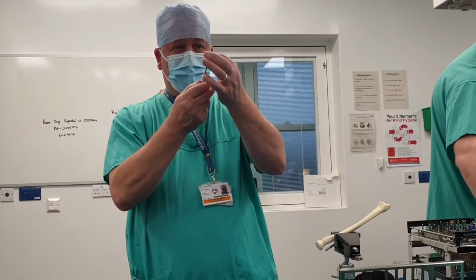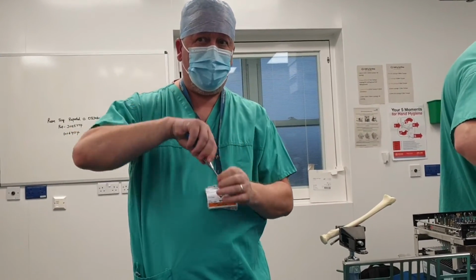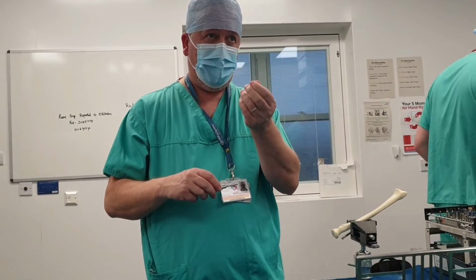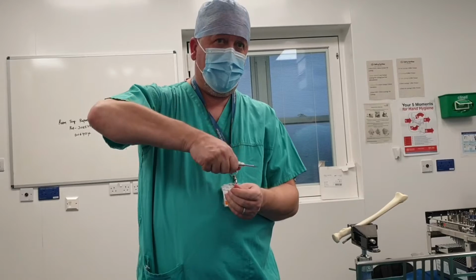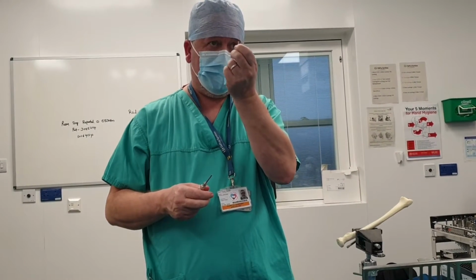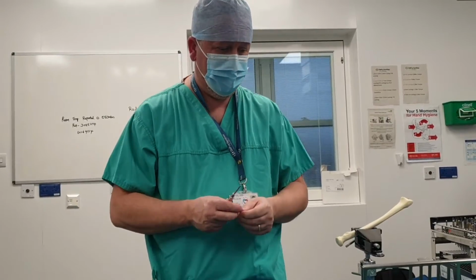So you see how that's on there? They want to compress it to the bone more, which is why they need a cortical screw. And they think that they can compress it better with a 2.7, but that's not true. This will still compress it just as good. No, we're talking about the screwdriver. So if you use the 2.4mm screws, then all we need is the 1.8 drill, and that's it.